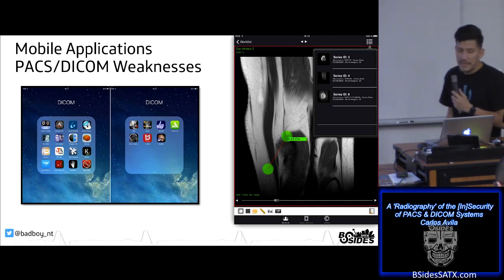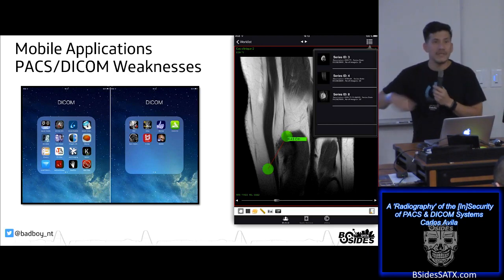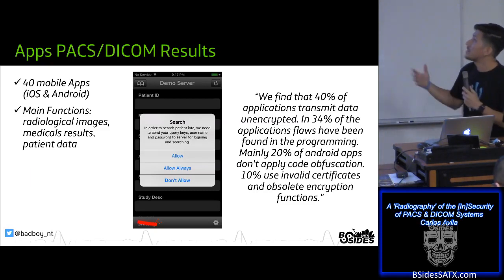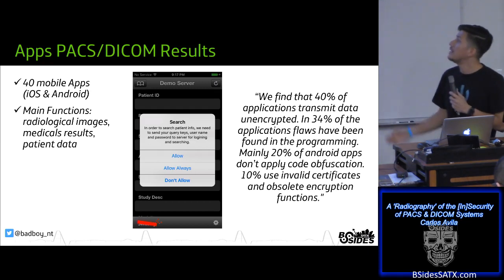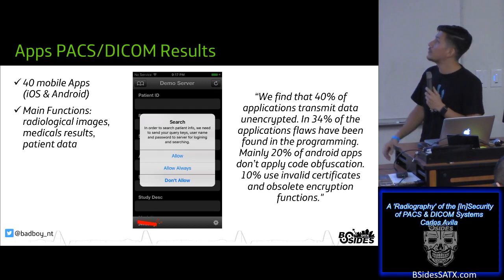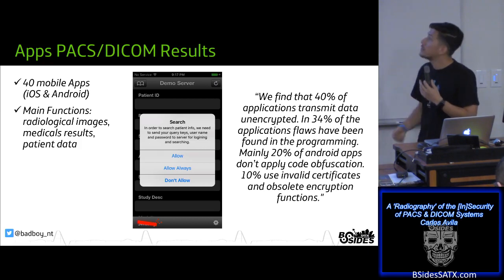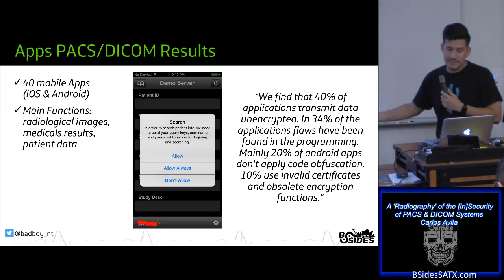For example, this time I wanted to test mobile applications which interact with PACS servers and DICOM protocols. So these are the results. I analyzed 40 mobile applications in iOS and Android. The main features are to manipulate radiological images, medical results, and patients' data. As you can see, the result is not good.